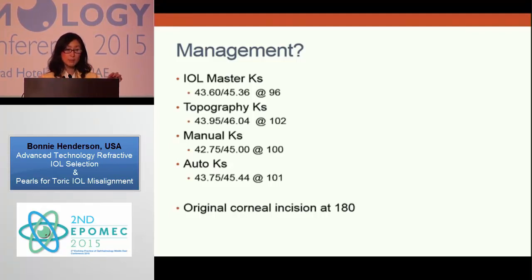You just break the epithelial seal, and with a blunt instrument, you can just go in and dissect out the corneal incision very, very readily. So I always tend to enter in the original incision if I can. That way you don't induce another factor that may cause astigmatism.